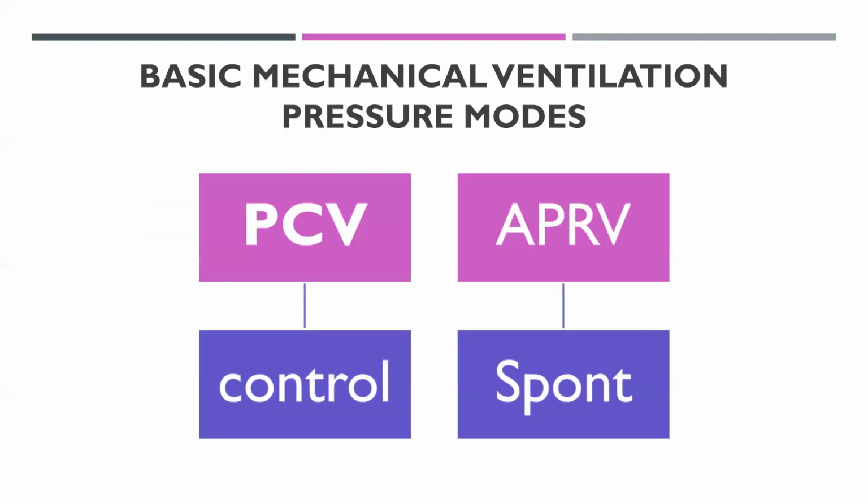Pressure mode ventilation. We will have pressure control ventilation. It has only control, but nowadays we don't use this at all. We add assist to it so the patient doesn't fight with the ventilator and cause air trapping.